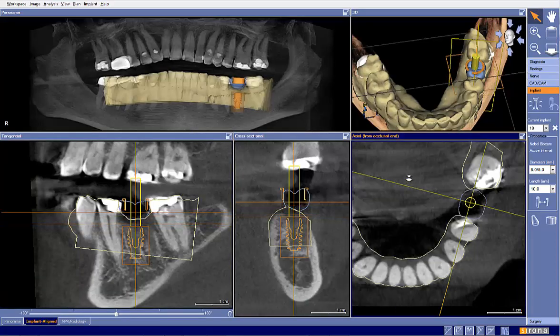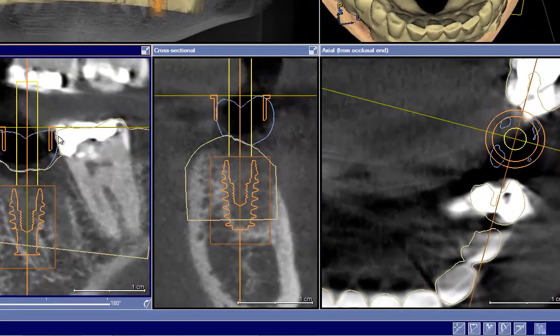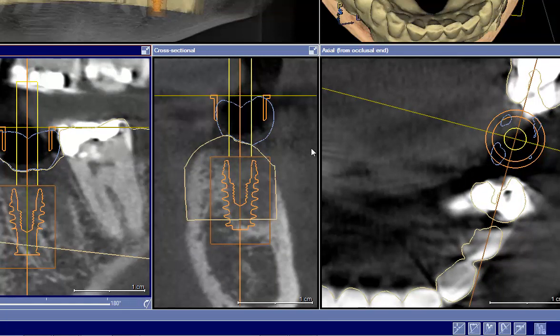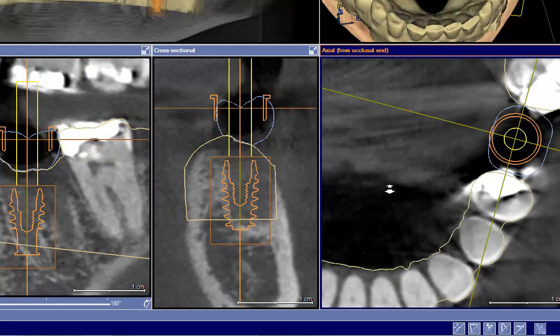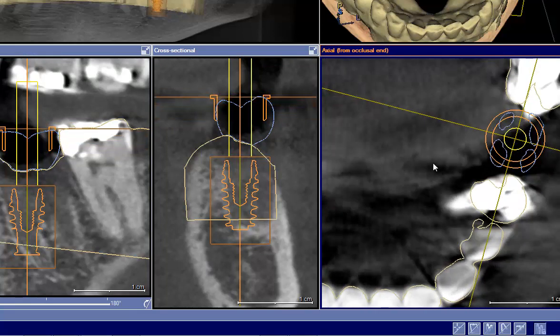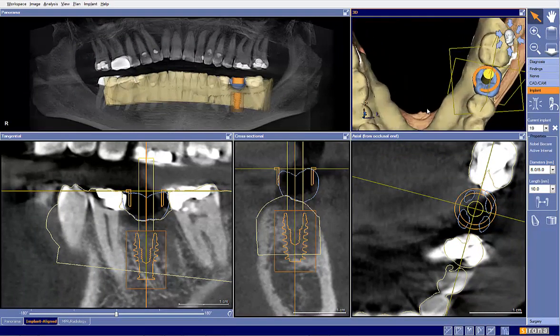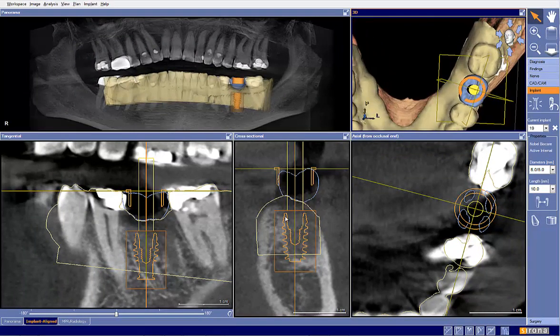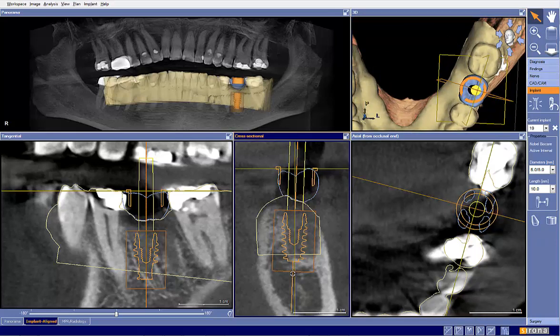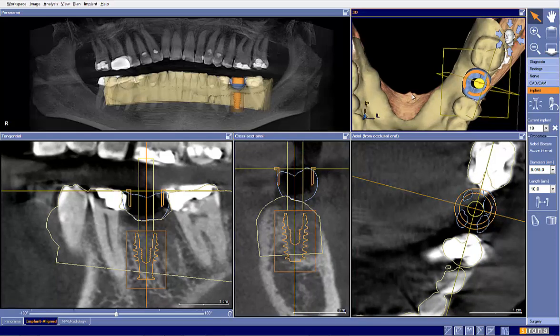Okay. Next would be our sleeve, and our sleeve position here. You can see from the movements that we made that now we're hitting the adjacent tooth compared to this adjacent tooth, so we'll just simply move that over. And then we may make a note to the CCAT that we may need to do a little bit of reprox on the adjacent teeth, although right here that looks like it may be some scatter that's making it look that way, because here on the CEREC model we can see that we actually have plenty of space there. So based on what I'm seeing here, everything looks good, just some minor tweaks.